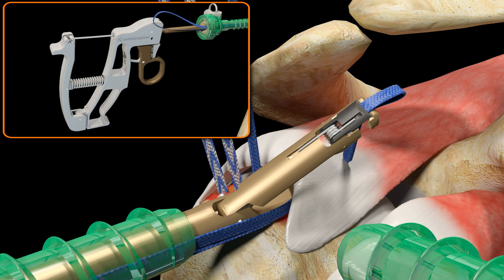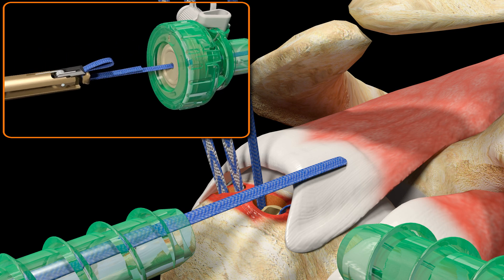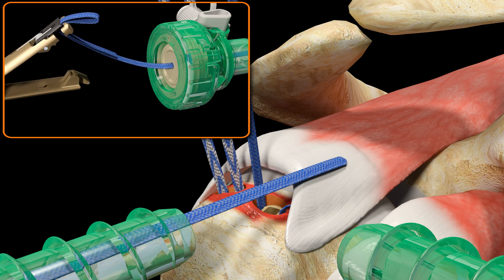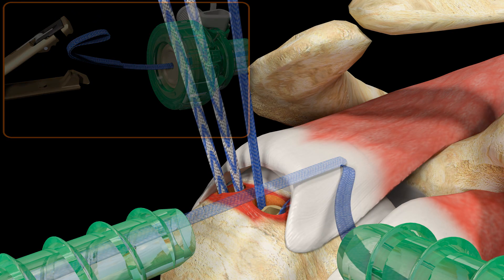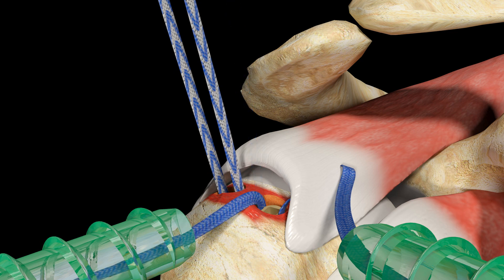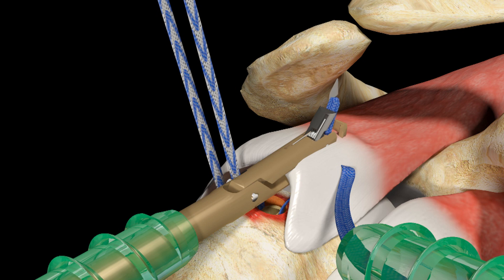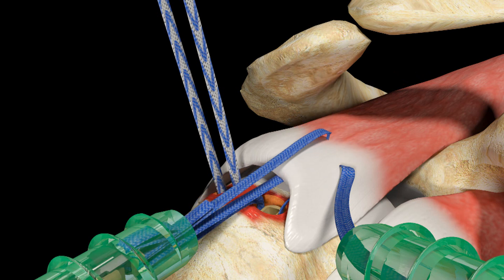The Ultra Tape will remain caught in the self-capture door in the upper jaw. Close the jaws of the TruePass suture passer and withdraw the device back out of the lateral cannula. The Ultra Tape is easily unloaded by pulling it out of the small window on the right-hand side of the upper jaw. Park the passed limb of Ultra Tape out of the anterior cannula. Retrieve the second limb of Ultra Tape from the anterior medial anchor and in the same way pull it back through the lateral cannula. Pass the Ultra Tape anterior-medially through the tendon adjacent to the first passed suture limb, ending with the Ultra Tape exiting out of the anterior cannula.